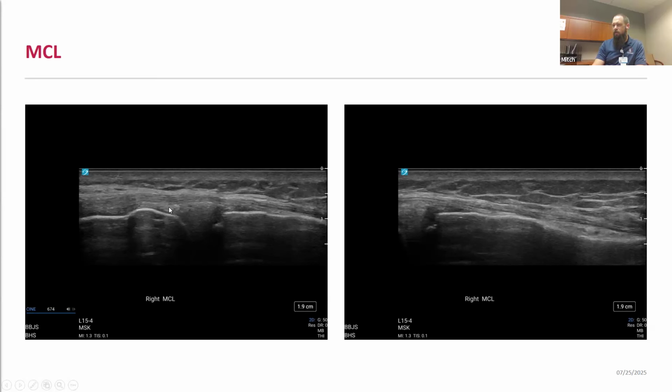And so we've got our more proximal meniscofemoral ligament and then our more distal meniscotibial ligament here. And so we're able to delineate between those. And then as we travel more distal down to the proximal tibia, we see the extension of that tibial collateral ligament down, inserting onto the tibia. And then we start to see some of our Pes Anserinus at this area as well.